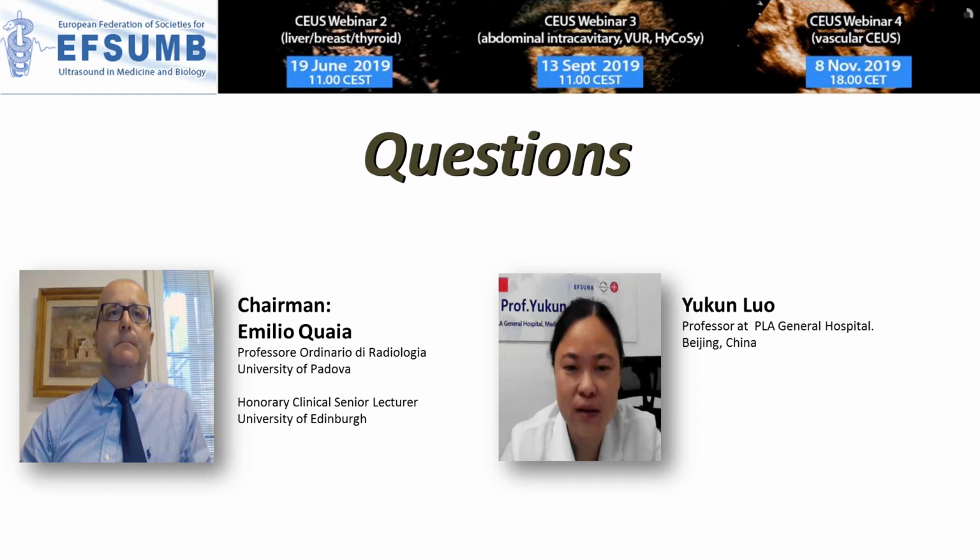From my point of view, let me ask you, regarding the ablation assessment by contrast-enhanced ultrasound. When you use contrast-enhanced ultrasound to assess the outcome of ablation in thyroid nodule, how long after ablation do you perform contrast-enhanced ultrasound? Just immediately and that's it, or do you repeat 1 week, 1 month after treatment? Could you clarify this point, please?